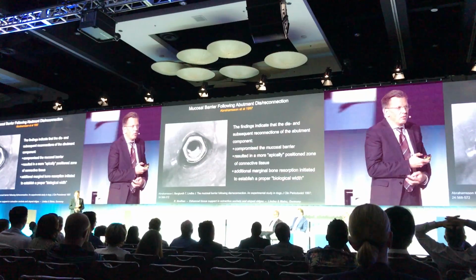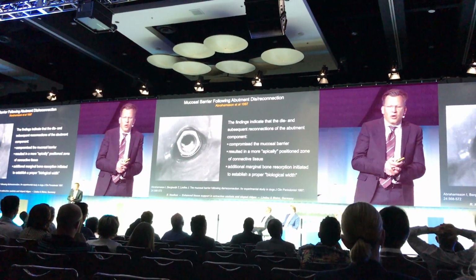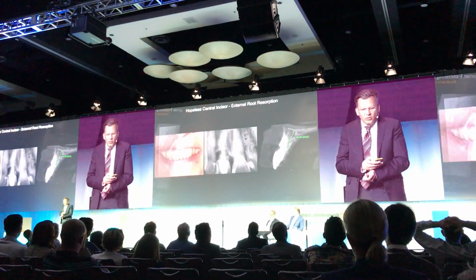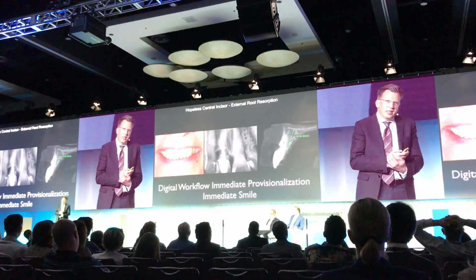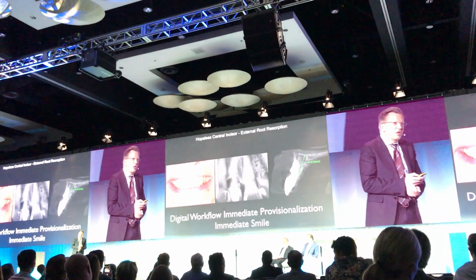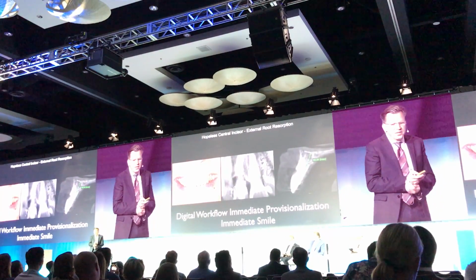1997 that when you subsequently reconnect your abutments, you are going to lose marginal bone. So here another case, how we treat maybe all our cases in future. This concept is called immediate smile, when you look for one abutment one time.